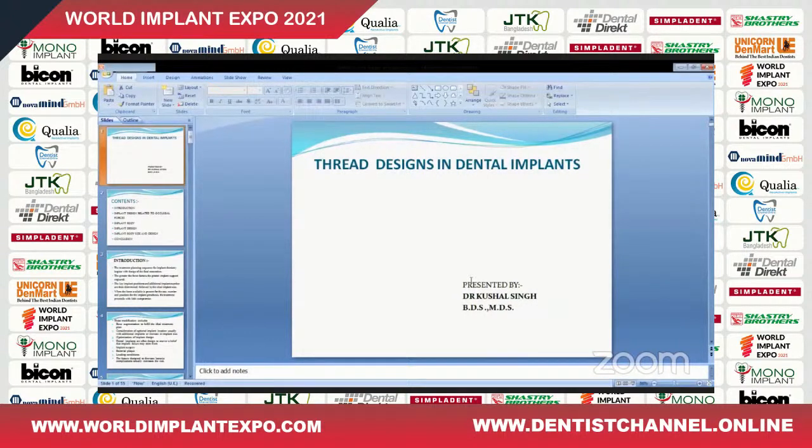For the introduction, the treatment planning sequence of implant dentistry begins with the design of the final restoration. The greater the force factor, the greater the implant support required. The key implant position and additional implant number are then determined, followed by the ideal implant size. When the available bone is present for the size, number, and position of the implant prosthesis, the treatment proceeds with little compromise. Now for the modifications, we have bone augmentation to fulfill the ideal treatment plan, and consideration of optional implant location, usually with an additional implant or an increase in implant size.